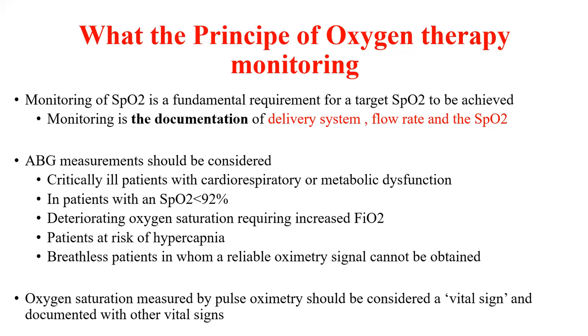So from here, we can give a message to our colleagues and healthcare providers. Don't call and report that you have an oxygen saturation of 90% and stop there, or say 90% on high flow. You have to tell which high flow, on which delivery device at that time, so you have good communication to tell what oxygen saturation you are having when you give the 3.